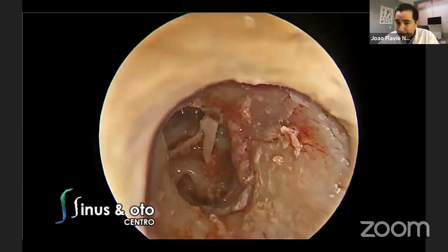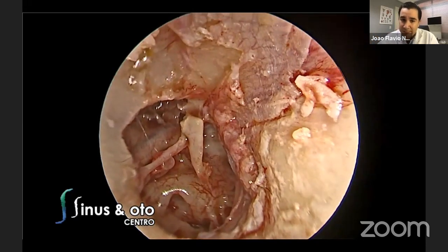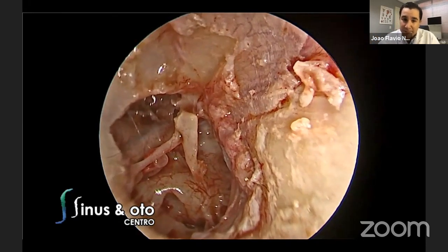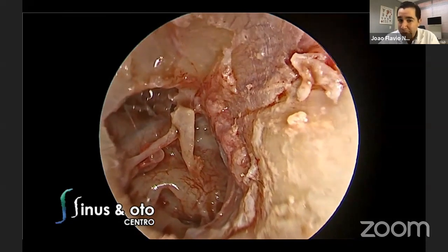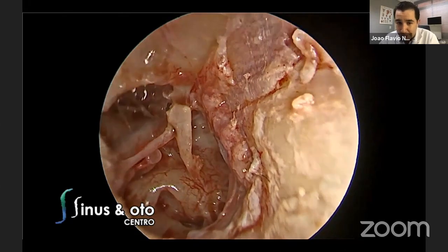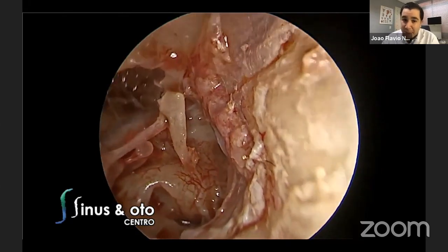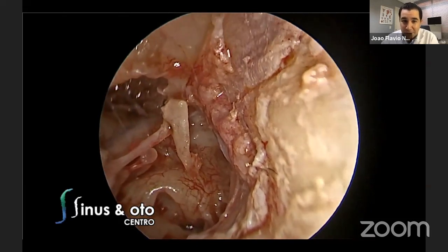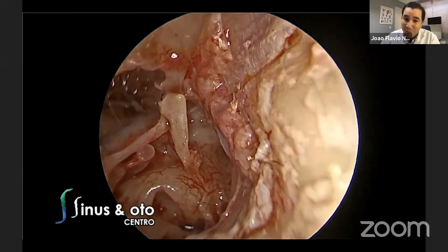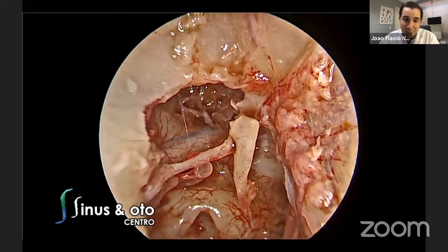But as you progress towards using angled endoscopes, you have to understand that it's more difficult. And sometimes you have to be more experienced. Sometimes we see a very experienced microscopic surgeon who only does microscopic surgery, but he wants to use a 70-degree scope on his first endoscopic surgery. This is not going to work out, and then maybe he or she will have some problems.